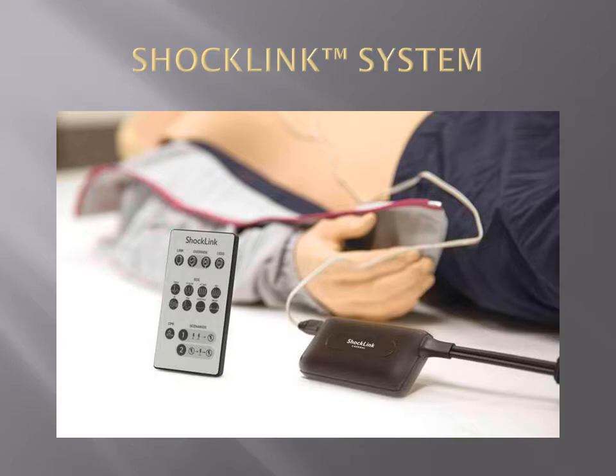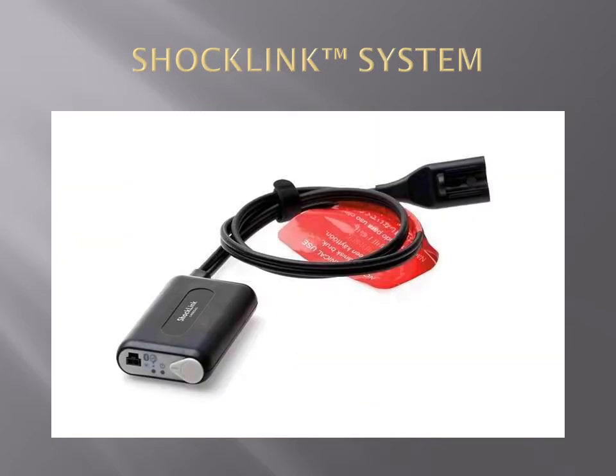This package includes the ShockLink device, user guide, defibrillator training pads for ShockLink, ShockLink remote control, and ShockLink pouch.